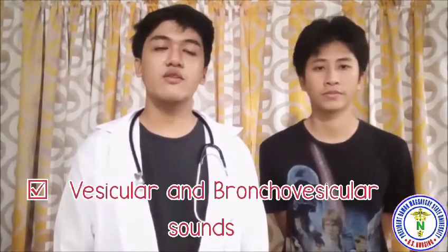Thank you, sir. The result is that the sound of breathing of the patient is vesicular and bronchovesicular sounds, which are the normal sound of breathing. This procedure will tell us if there are any problems to the lungs of the patient.